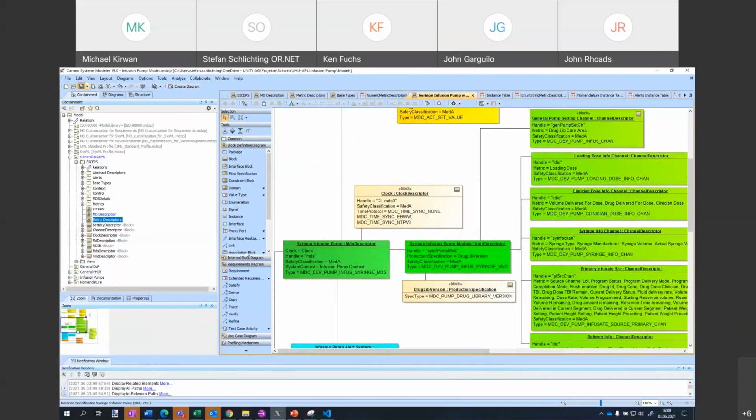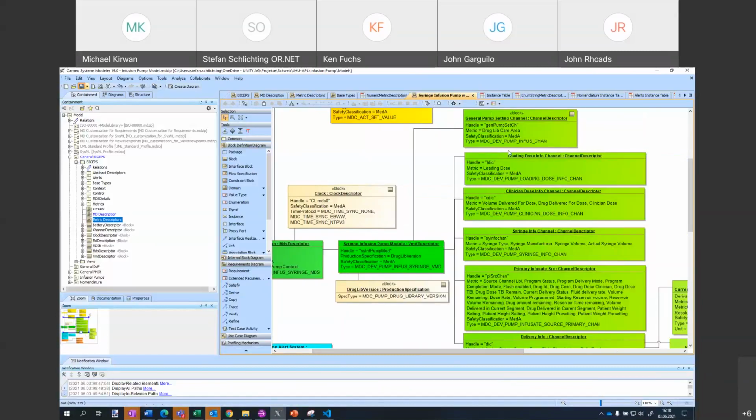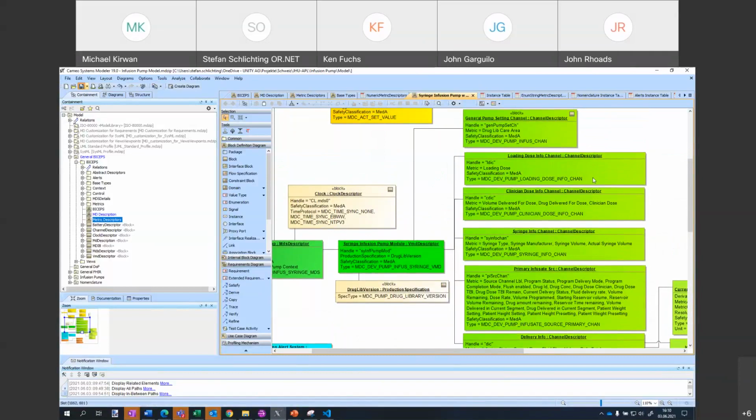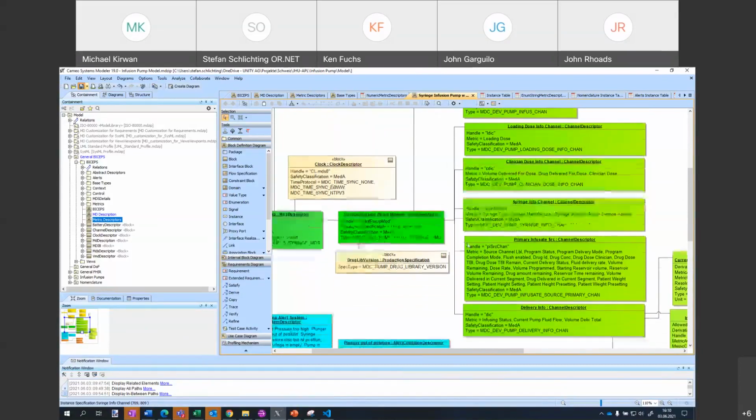So we have an MDS description here, where just the type is currently filled in. We have a VMD, which is the module for the infusion pump. That's exactly the same as in the IEEE model. And then we have different channels representing the different measurements or settings of an infusion. For example, we have something regarding the loading dose, a clinician dose, a syringe information channel, and a primary infusate source. And we have something that represents the delivery information, so what is delivered to the patient.